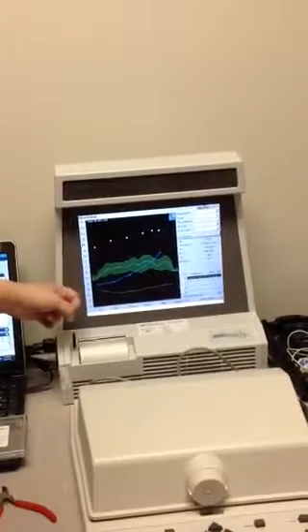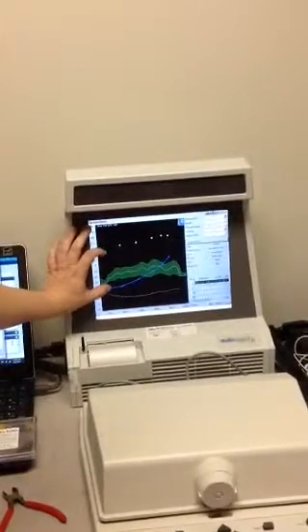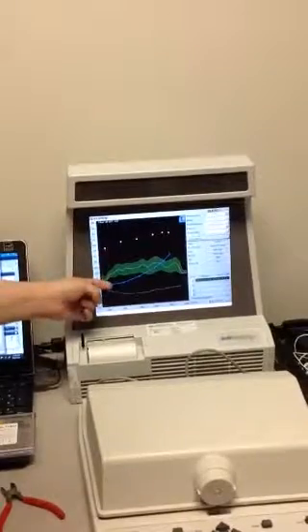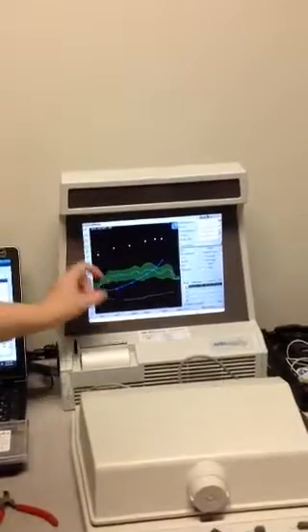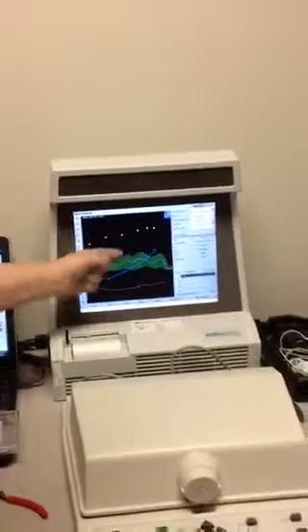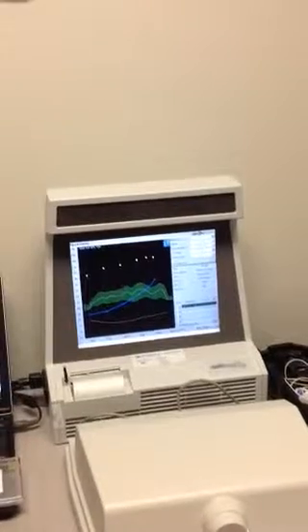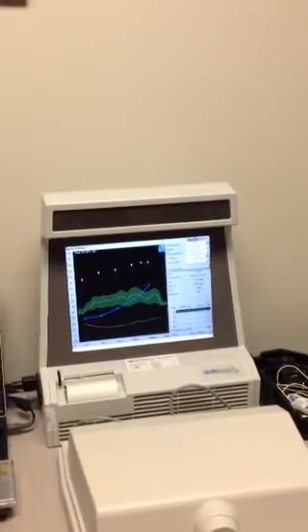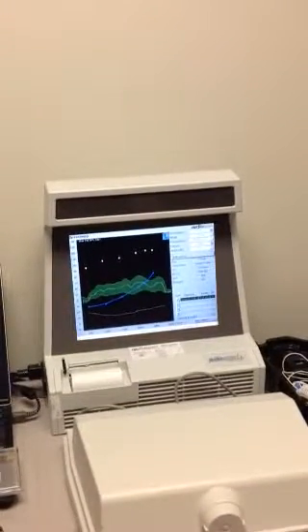When you measure 65 dB, you want 65 dB to roughly be halfway in between the threshold and the LDLs. Some people like to look at the threshold and say, I want it 20 dB above the threshold. So you can eyeball it either way. Now, if you want it halfway, sometimes that will be too loud for the patient. So it really will depend on the patient's subjective opinion of how this sounds. So you can do it either way.